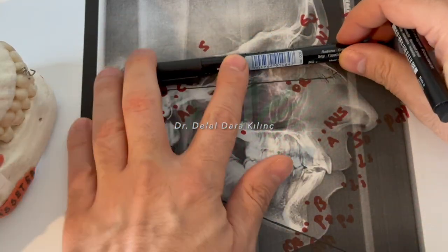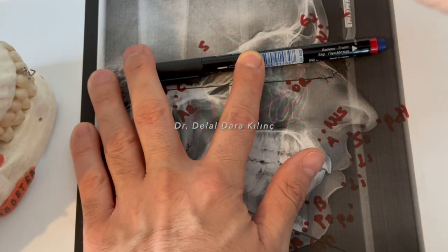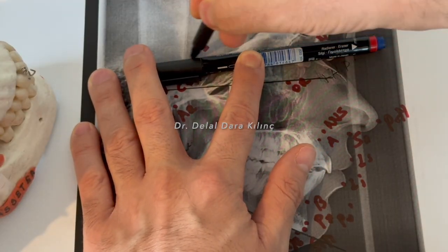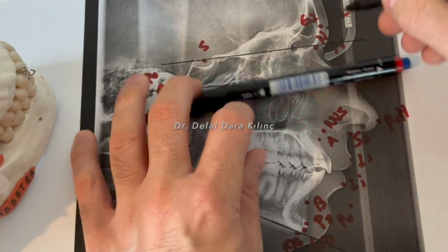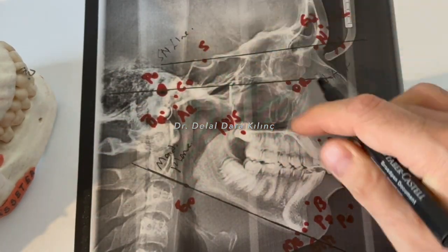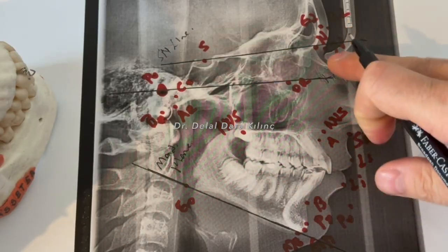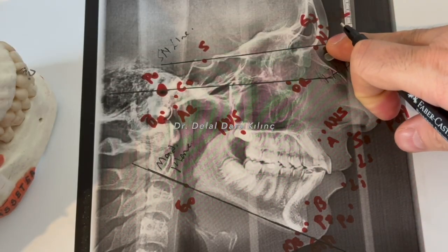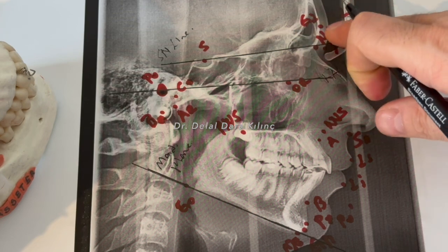And Nasion, it's here. It's the Sella-Nasion line or plane. And here you see the Frankfurt horizontal plane, the Sella-Nasion plane, anterior cranial base line or plane we call it.